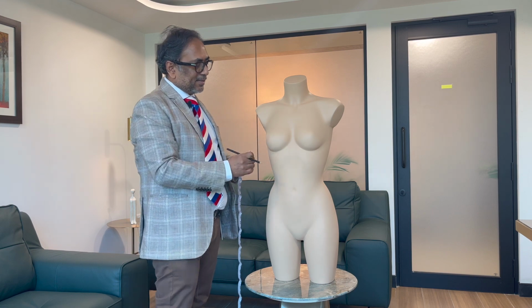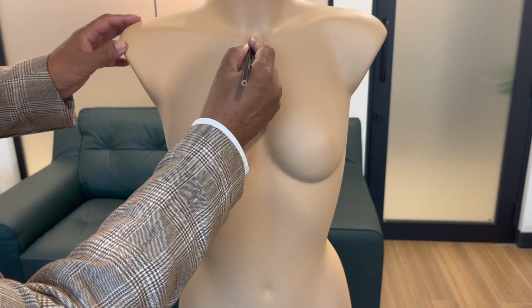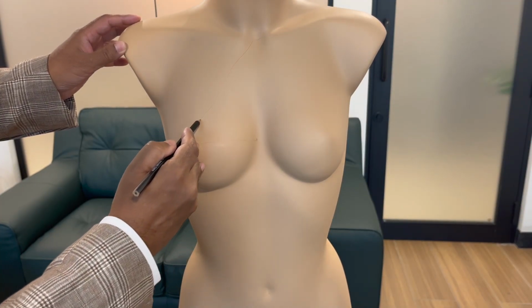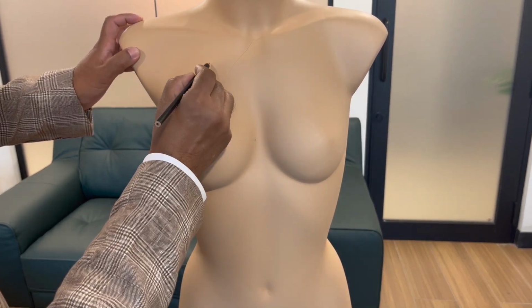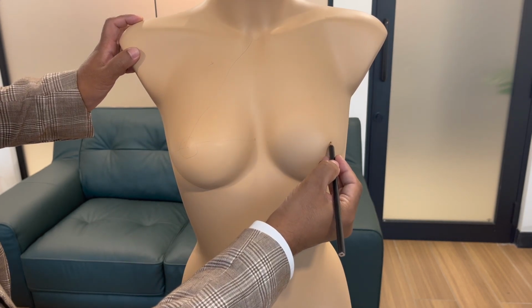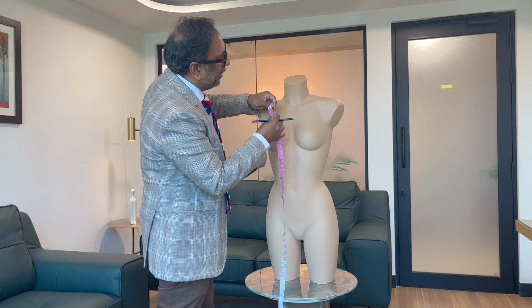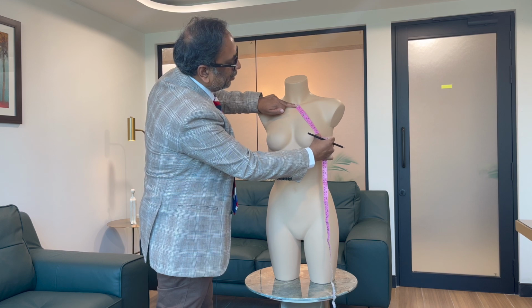Now, the second most important measurement is the sternal notch to nipple distance. We measure this distance, and this is generally around 20-21 centimeters. We mark this particular distance, and the same thing is measured on the opposite side over here, and this is also marked.